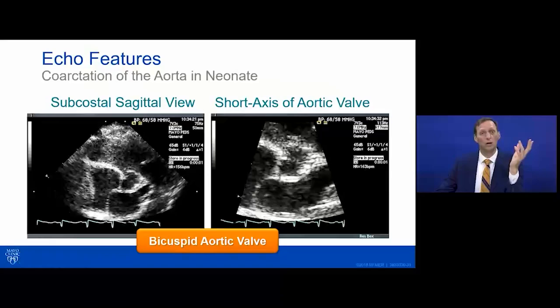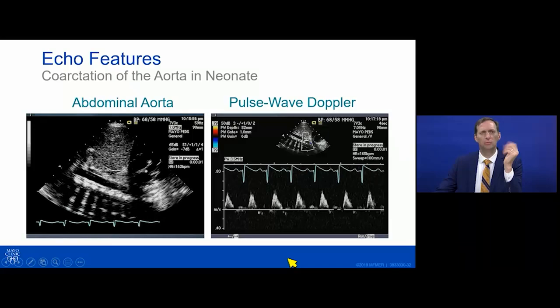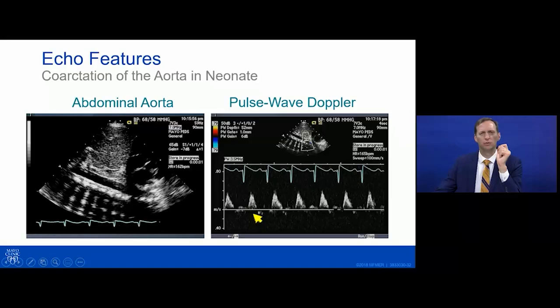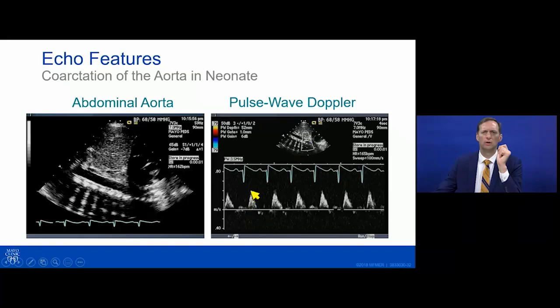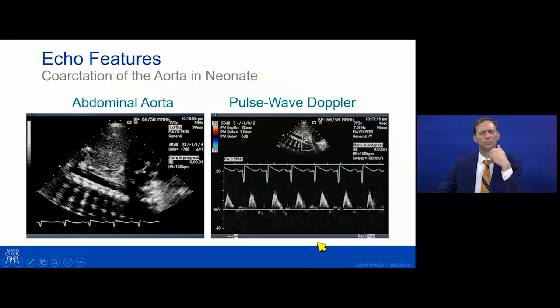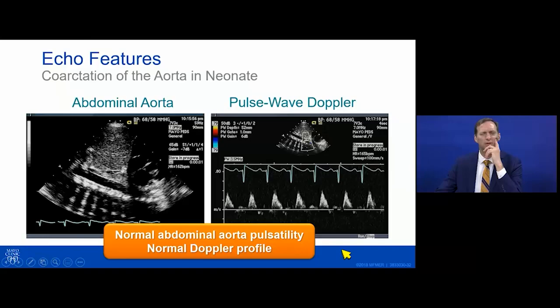On short axis you may confirm a bicuspid aortic valve. The abdominal aorta Doppler signal in a neonate may look surprisingly normal — brisk upstroke, reversal, return to baseline — which seems inconsistent with severe coarctation. On parasternal short axis at a higher level, you may find a large PDA with an almost entirely right-to-left shunt. This is the key: don't confuse the ductal arch for the aortic arch — in fetal life the ductus forms its own arch.